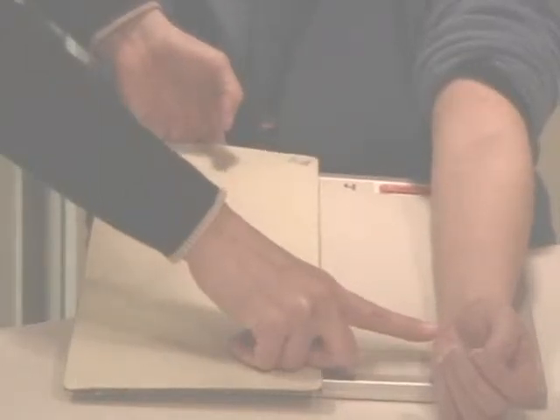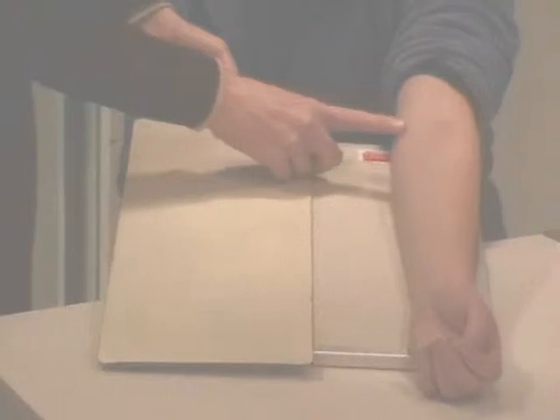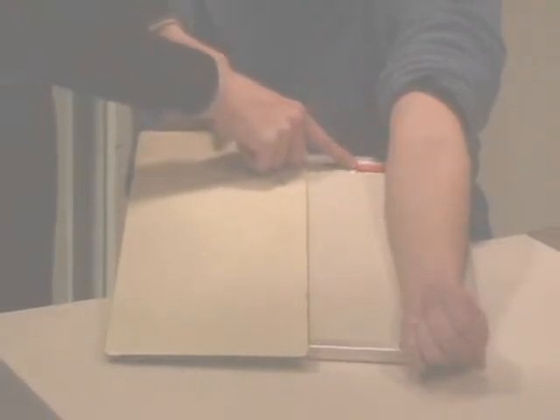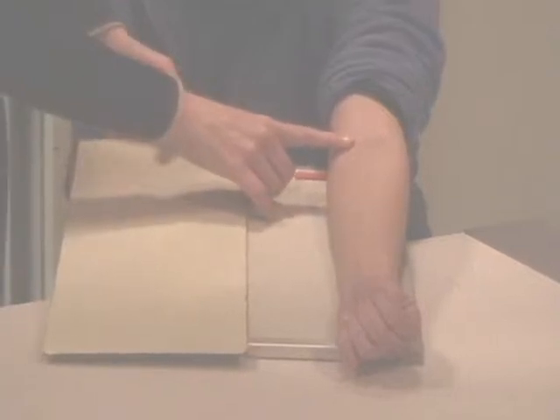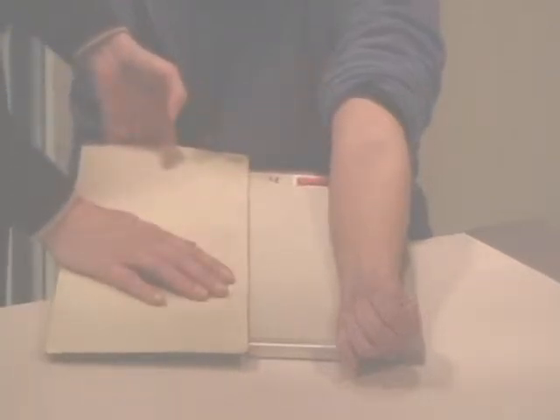You'll take the chance of clipping pertinent anatomy. And then make sure your elbow joint is 1 inch from the ID blocker, or you could possibly clip the elbow joint, and again, that is pertinent anatomy.